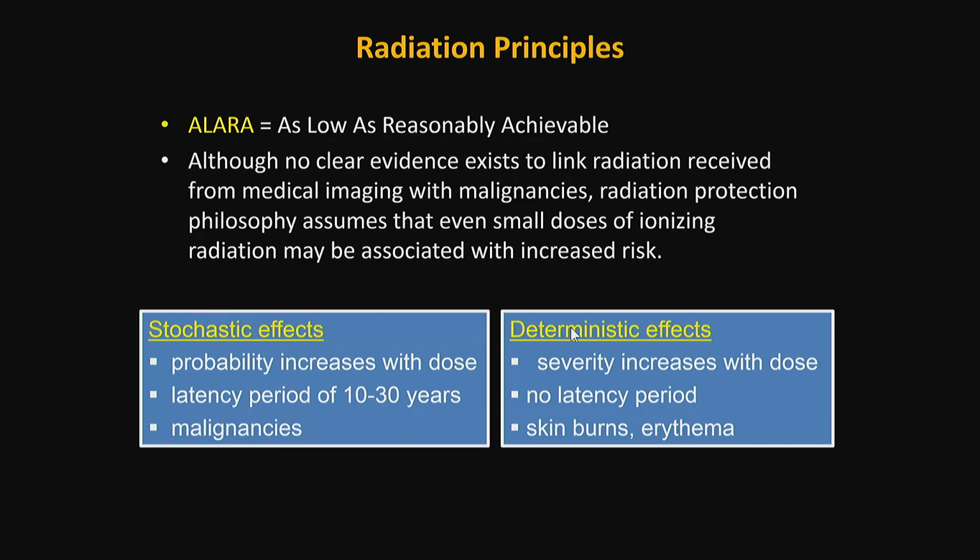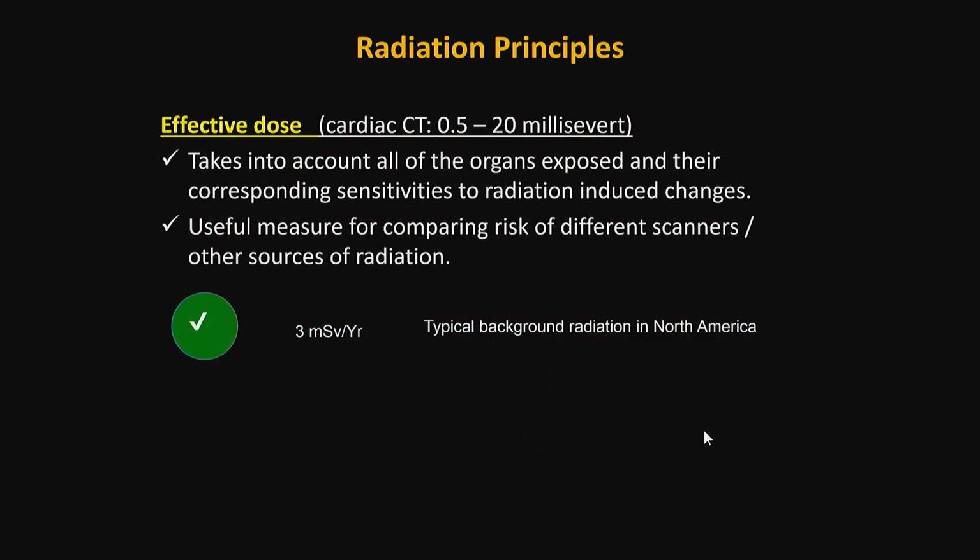On the other hand, if a patient is exposed to a very high dose in a single procedure, and this typically happens from long-term invasive procedures, even though this is rare, these are effects where the severity increases with the dose, and the example here is skin burns and erythema.